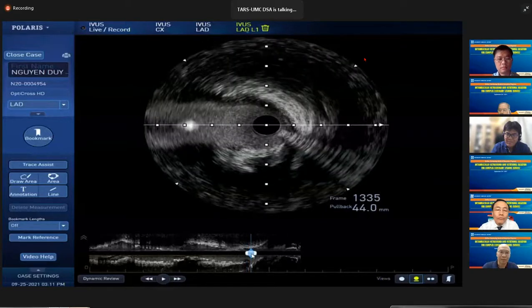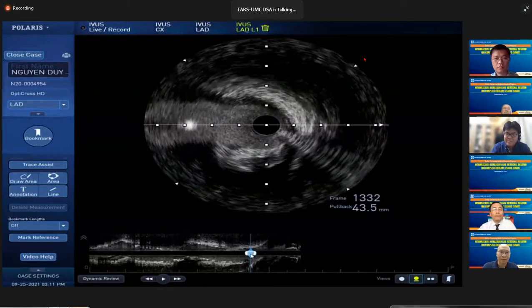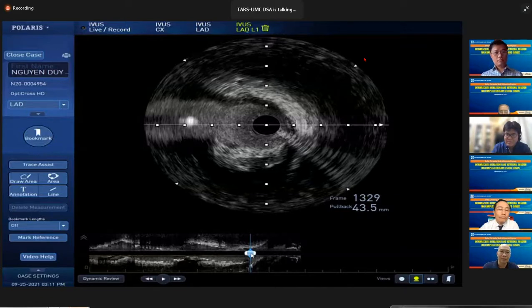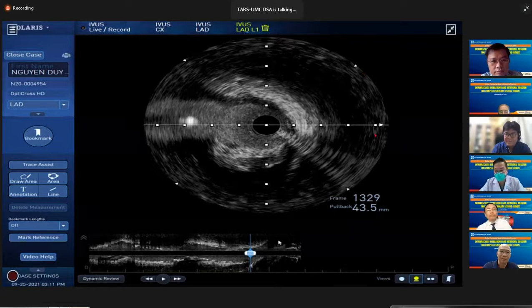You see the circ ostium and the Y from the 9 o'clock? In this view, the circ ostium is not so severe. At this bifurcation, we see the plaque from 4 o'clock to 9 o'clock, maybe mixed plaque. Opposite to the circ ostium, we don't have any lesion.